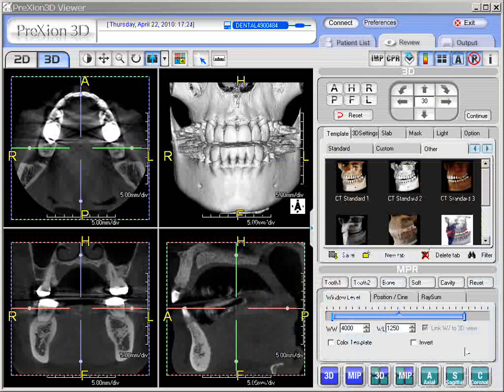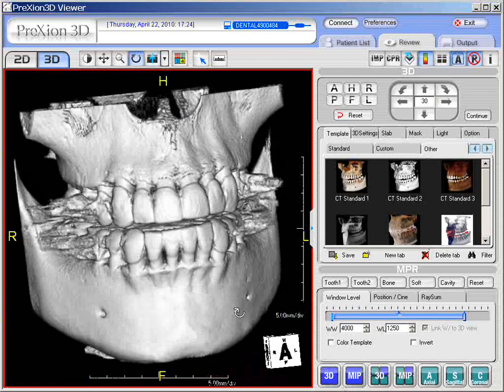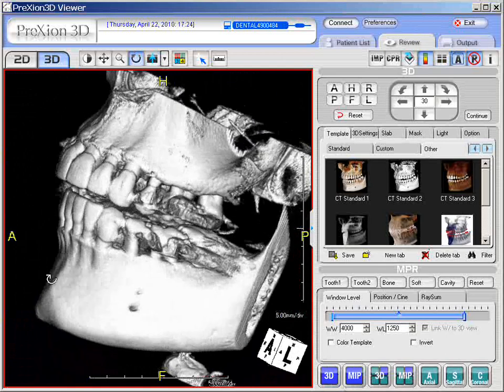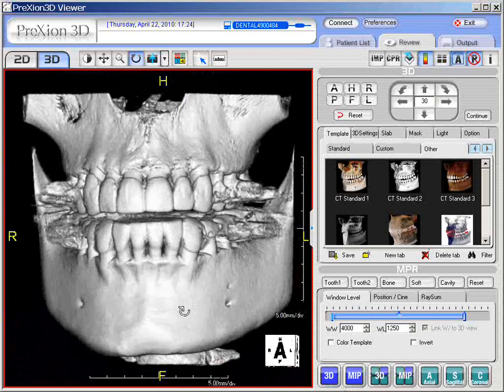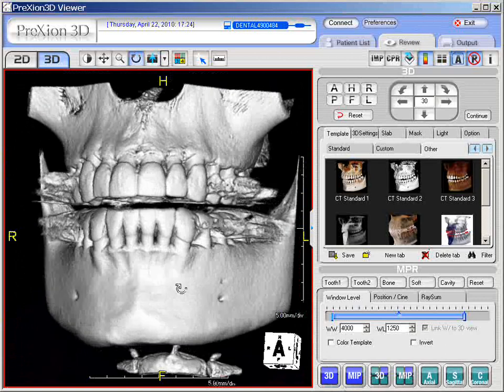Let's start by manipulating the 3D image with the mouse functions first. We can launch the 3D by itself with a double left click or by pressing the 3D icon. If you hold the left click of the mouse, you'll get a rotation symbol. When you rotate, you can see the orientation box moving with it — moving right or left, up and down. That is the rotation with the curved arrow.